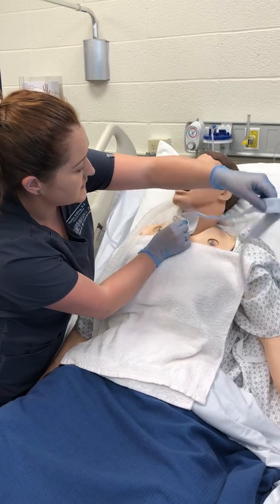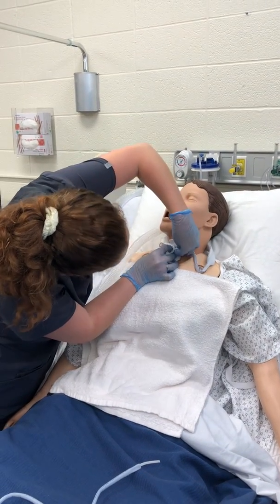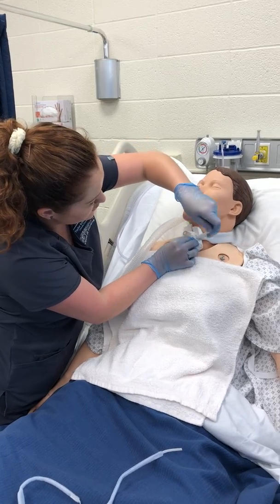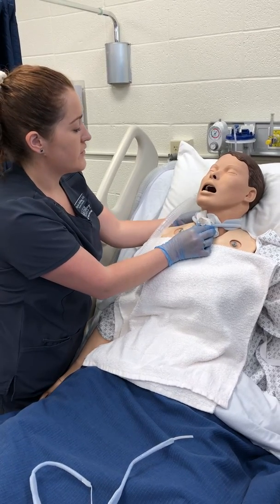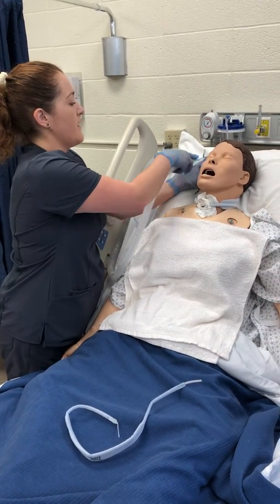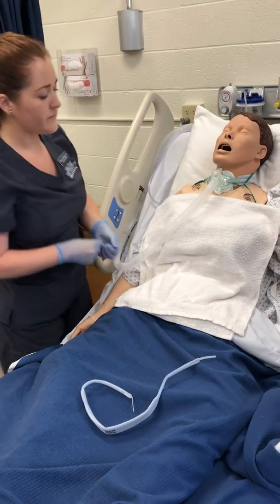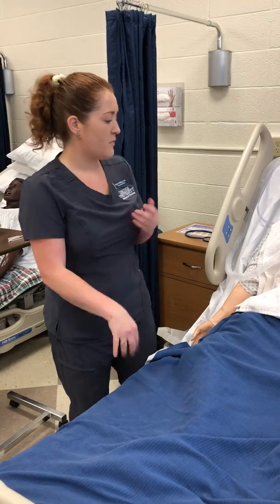And undo this one and discard that. Now with the trach ties, you want to make sure they are snug but that you can still fit about two finger widths in there. I'm going to go ahead and replace the oxygen as ordered, remove my gloves, discard my supplies, perform hand hygiene, and document all relevant data.